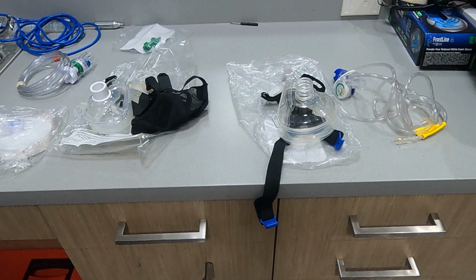So we can use CPAP on asthma patients, COPD patients, and CHF patients who are awake, alert, breathing on their own, and maintaining their own airway. The breathing on their own is important because this just forces air in. It doesn't actually provide ventilation at all.